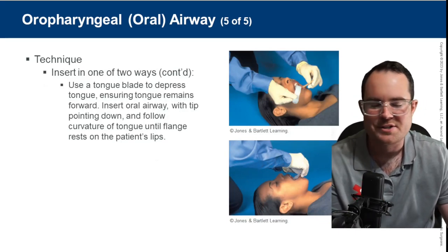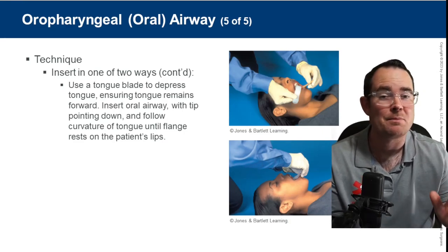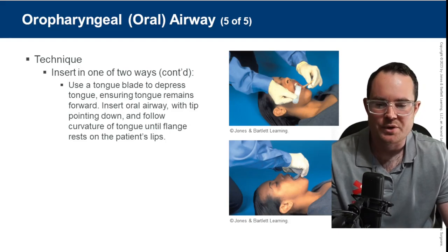Someone here is using a tongue depressor — not necessary for most patients. Some patients with an insanely large tongue might benefit from it, but it is not mandatory.